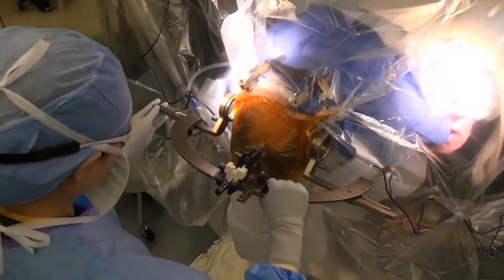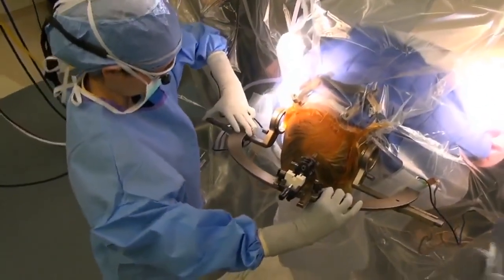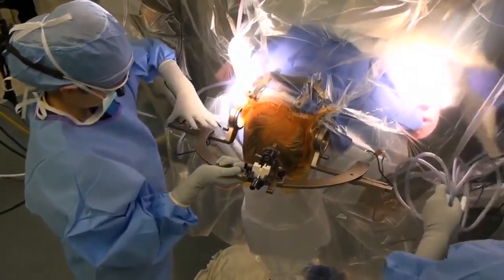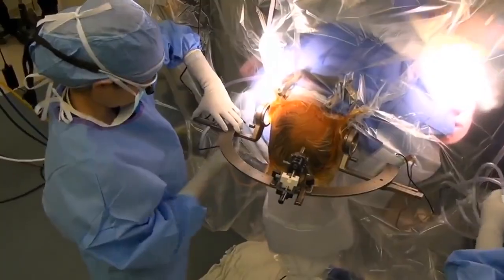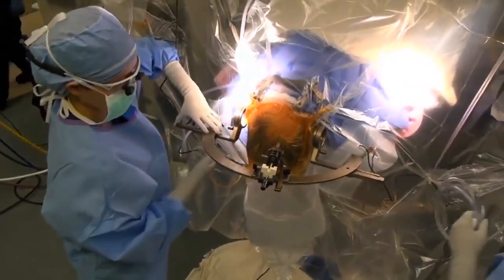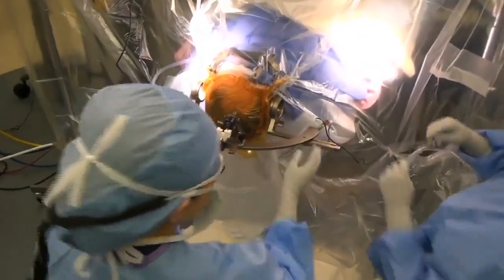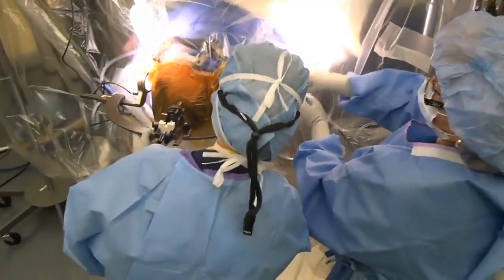Yeah, I placed the X. Oh yeah, I did. I checked it. Okay. Okay, ring is 68.